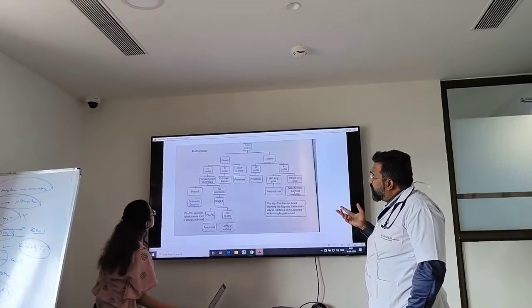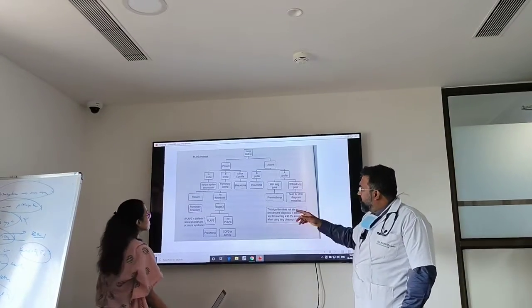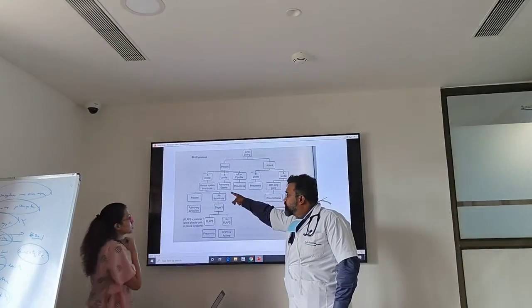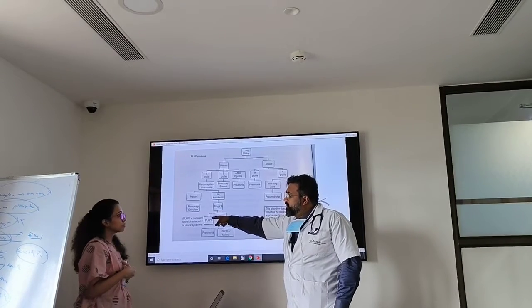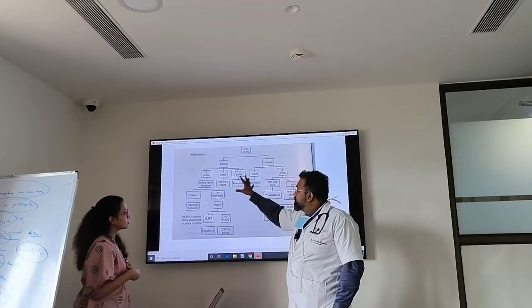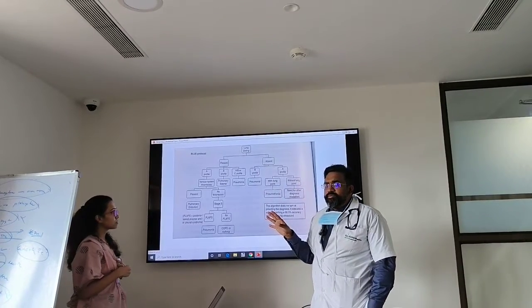Once you get anterior lung sliding with A lines, as I told you, there is more likelihood that the lung is normal. So if the lung is normal, you have to look at venous system thrombosis. If DVT is present, then that is pulmonary embolism. That's why the patient is breathless. This is a protocol done for breathlessness. You are understanding the protocol for breathlessness.